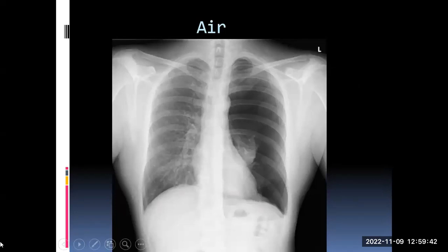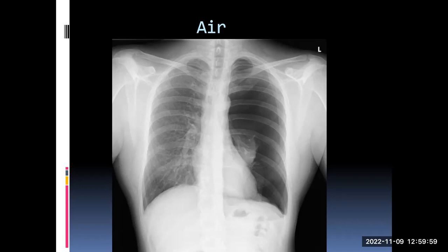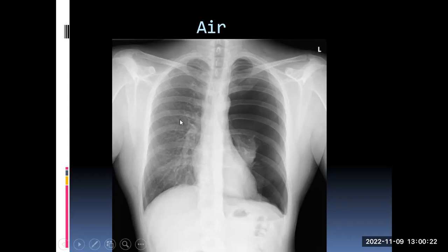Now I am going to talk about the presence of abnormal air — mainly concentrating on emergency and acute presentations that you might encounter when you are alone and need to act quickly. Air should be within the lung and bronchial tree only. Abnormal air could be within the chest cavity, outside the chest cavity, or even within the lung itself. This is a pure and simple pneumothorax — you see the collapsed lung tissue with no lung markings beyond it. We do not look for the blackness; we look for the absence of lung markings. If you have six anterior ribs before the hemidiaphragm it is a well-inspired film.